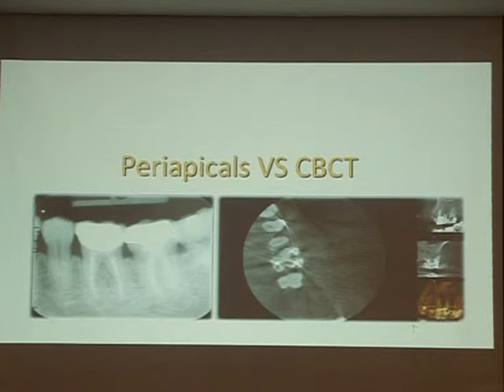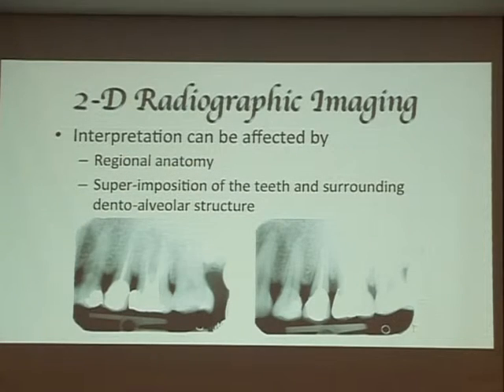So in endodontics, a lot of people argue, should we be using cone beam CT or periapicals only? A lot of people are still fighting over whether we can expose the patient to more radiation in order to get more information. I told you I have a cone beam, so I'm more on the cone beam side. I could be a little bit biased, because all your X-rays are only 2D. We are working in 3D.